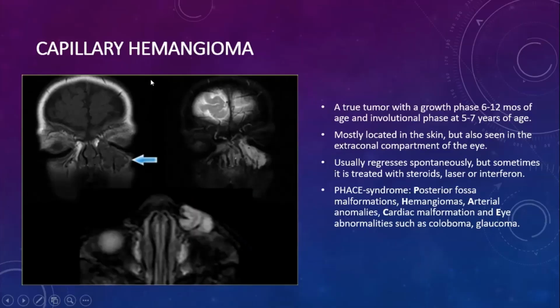Another, the vascular lesions. When pertaining to vascular lesions, when there are multiple iso-intense soft tissue lesions noted in the periorbital area with heterogeneous enhancement, mostly they will be noted in the pediatric age group and involute in 5 to 7 years. We have to think in terms of capillary hemangioma. They may be present with calcification or they may not.